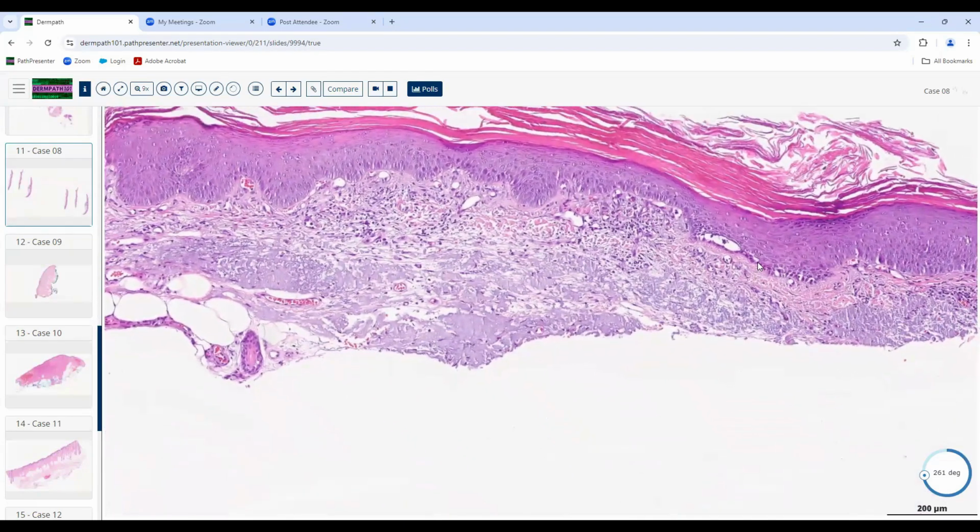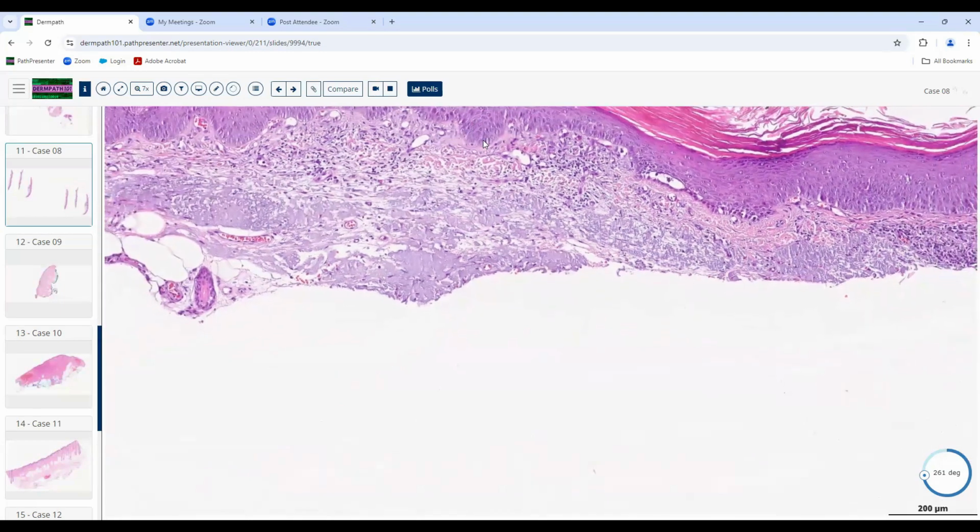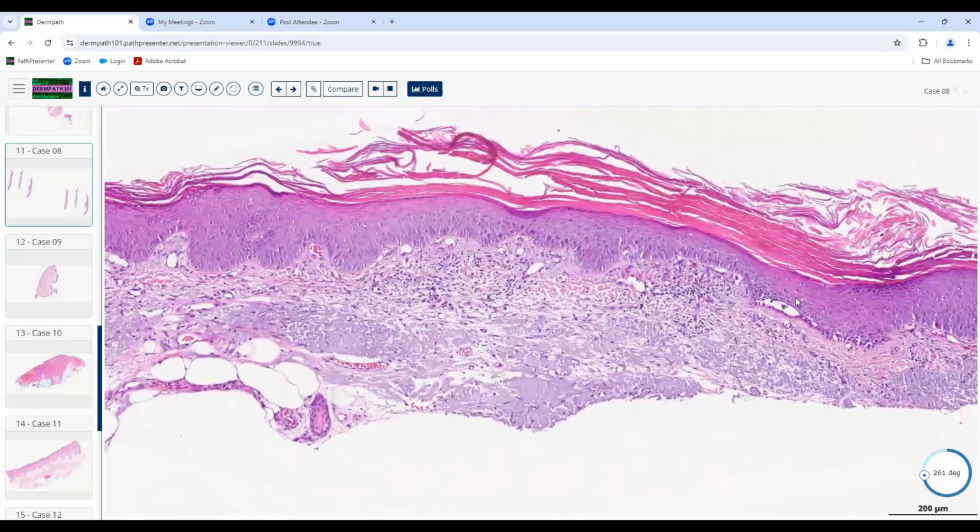And this has one other finding that's kind of interesting. It's got this acantholysis here, okay? Now that's not a criterion for the diagnosis of PRP. You don't have to have it. But if it's present, it's a helpful clue, because you do not usually see this in psoriasis. You don't see it in atopic dermatitis. You don't see it in mycosis fungoides. So if we see this in the setting of a widespread psoriasiform dermatitis that's got these other changes that I mentioned to you, that's like, well, boy, that really adds fuel to the fire, if you will, that it's really PRP, more likely to be PRP.